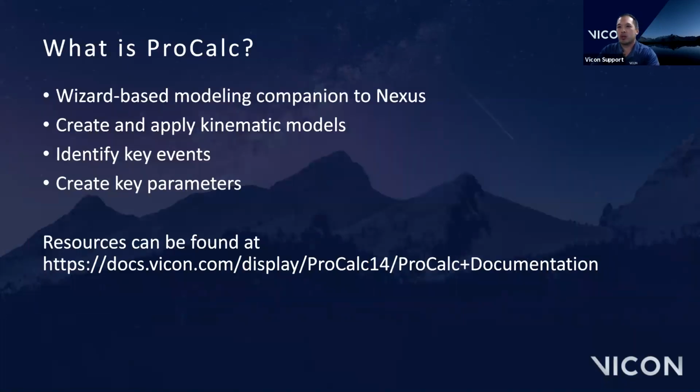So what is ProCalc? Well, it's a wizard-based modeling companion to Nexus. And what we mean by that is you don't need to learn a scripting language in order to use it. What'll happen is if you want to, let's say, get a certain output or anything like that, it will prompt you with different inputs that you can use.